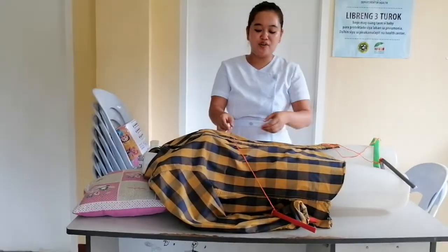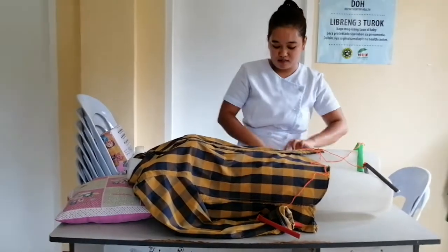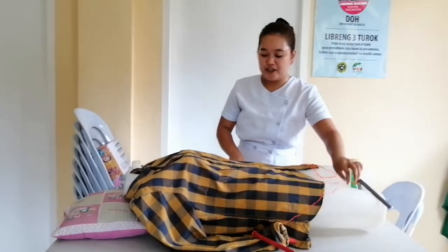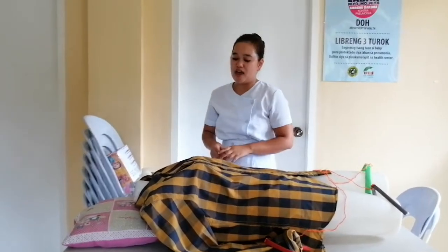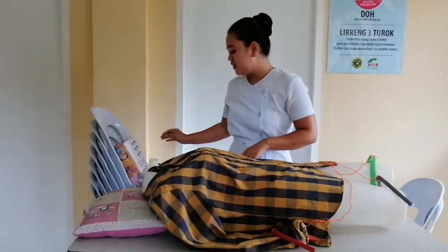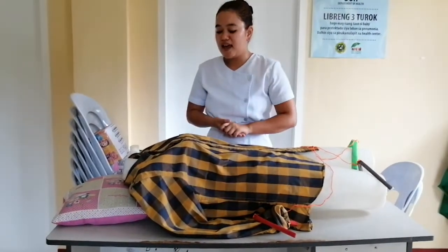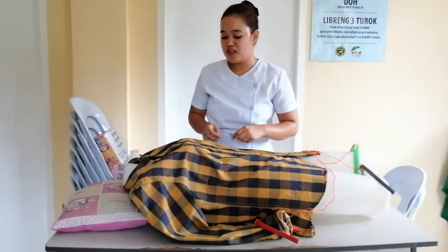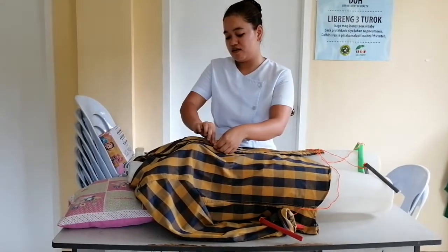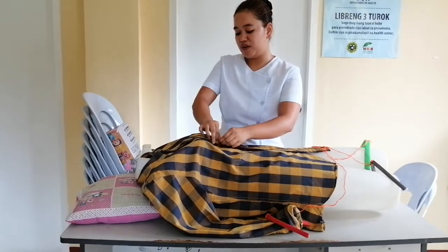And then we're now going to expose the chest of the client. But before that, you're going also to ask permission again from the client before placing the leads on the chest of the client. So ma'am, can I open again your buttons or your clothes? If the client's response is yes, you may continue doing the procedures.